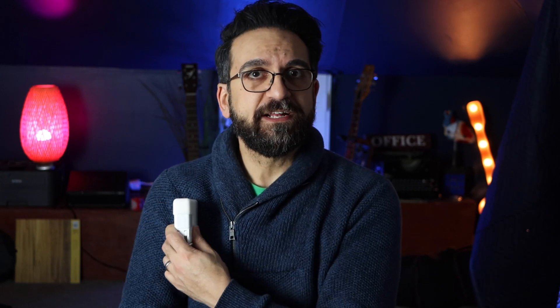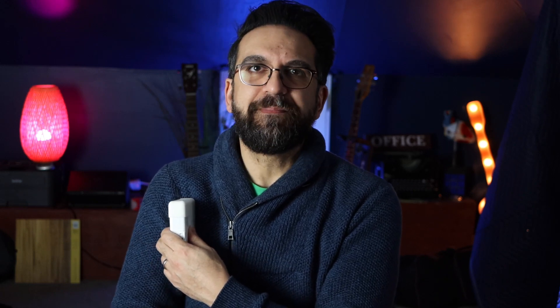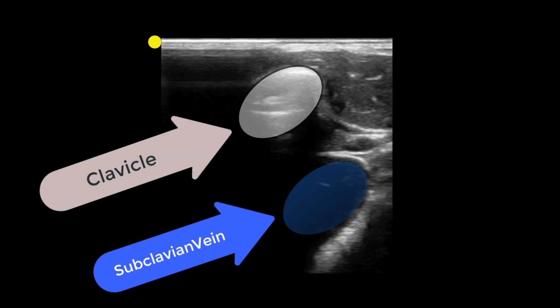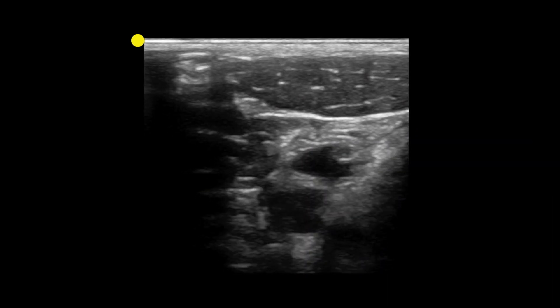Once you plop the probe on the shoulder and drop it down a couple centimeters, look for your target. If the axillary vein is nice and big, go for it — try to cannulate there. If it's not big enough, start moving more medially toward the sternum. As you move medially, that axillary vein will get bigger and bigger. Follow that vein infraclavicular — under the clavicle — until the subclavian vein ducks under it, then move the probe out one to two centimeters so you see it nicely in short axis.